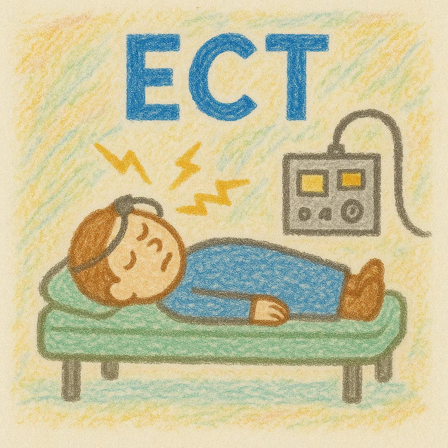So they're going to be bag valve masked during this whole time. Typically, we're going to do hyperventilation. This is usually going to be somewhere in the range of 30 breaths per minute or more, because hyperventilation can help lower the seizure threshold and therefore make inducing a therapeutic seizure easier.